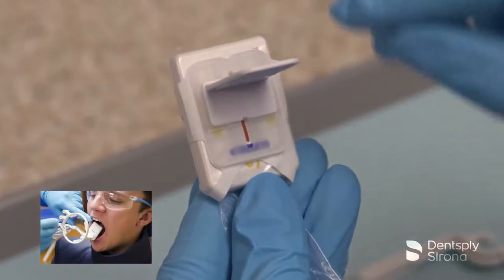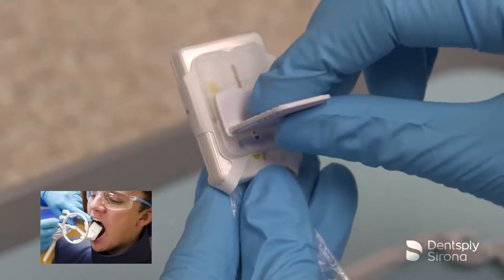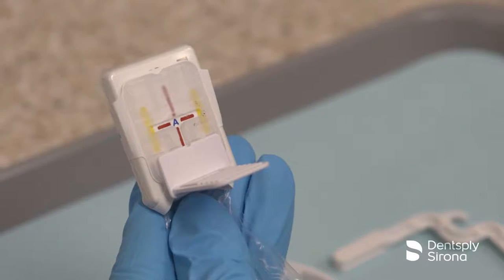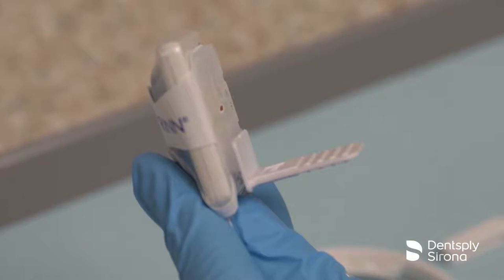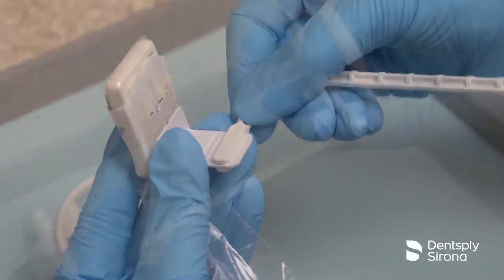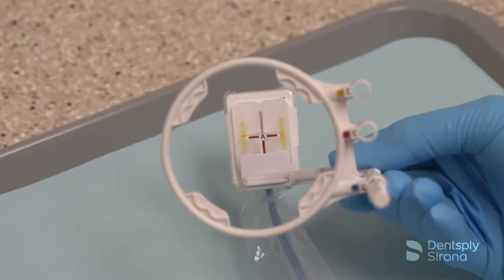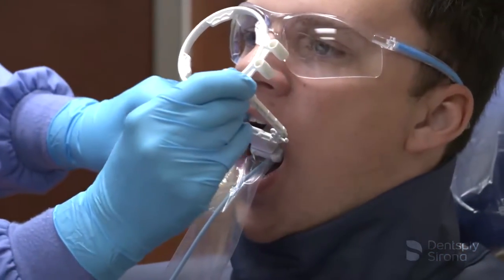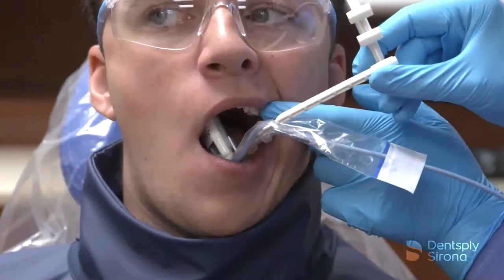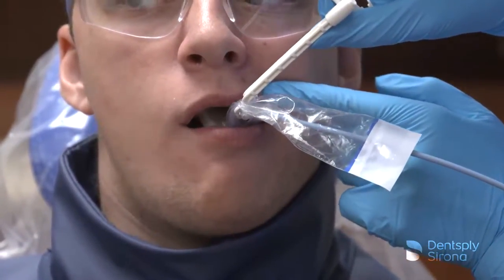When taking anterior images, slide the bite piece from its starting point down the main channel and set it into place at the bottom of the sensor and base plate. Note that this will take the bite piece along the blue edge or at the bottom of the sensor's active area. After placing the arm and ring, visually inspect to ensure the holder is in the center of the ring. For optimum patient comfort, place the sensor in the center of the patient's mouth and instruct the patient to close slowly. Utilize the small loop on the side of the arm to hold the sensor cord out of the way.